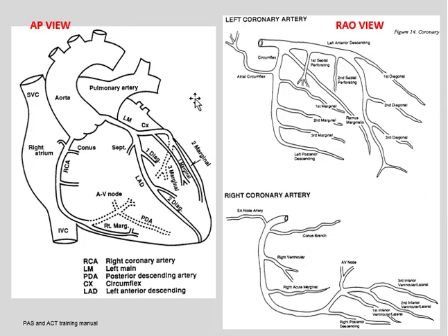This is the equivalent of an AP view of a patient lying down. In the RAO view, the heart in profile, the LAD goes across the anterior wall, but it sort of deviates slightly. The right coronary artery is simpler. It's one big fat juicy vessel feeding the bottom of the heart, but it branches. It bifurcates into the posterior descending artery in the bottom and the posterolateral artery going higher up. Again, this will become clearer as we move on, and you will learn how to identify these.